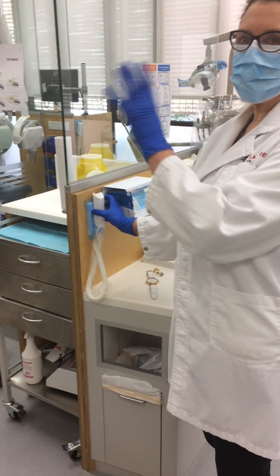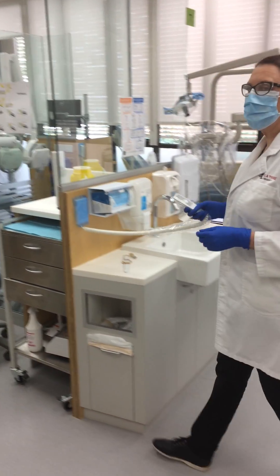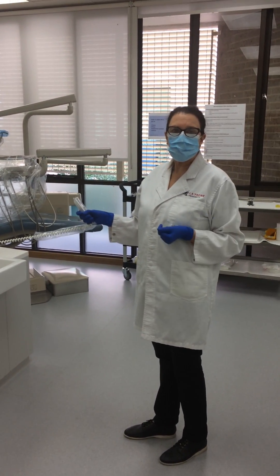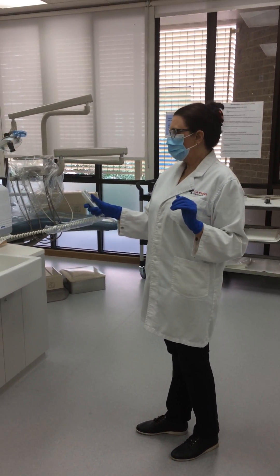You always face the patient so you can watch if they move — and Dexter has been known to move. You lift it off, step back, and ask the teacher that you're ready for an exposure. Once your teacher is watching you, you can then expose.